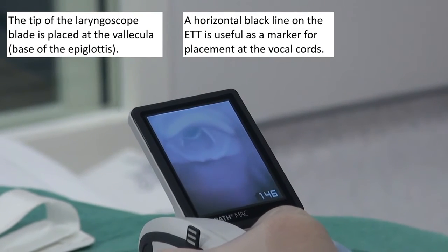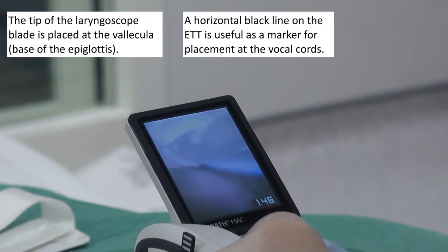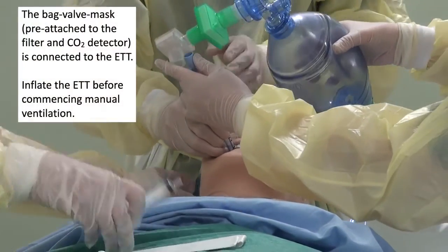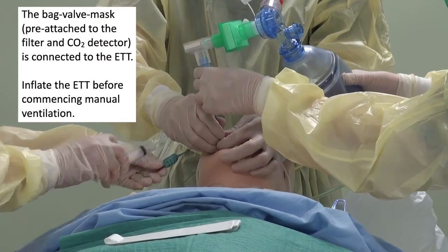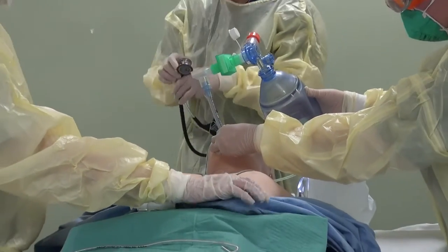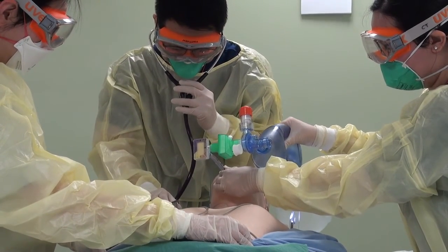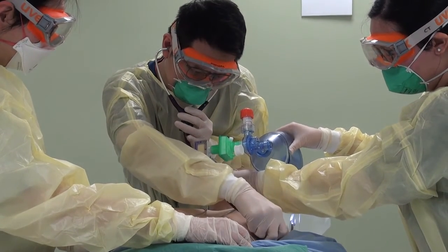Switch your view to the video screen and gently introduce the ETT while keeping the tip of the blade at the vallecula. The ETT is introduced past the vocal cords and the stylet removed. The bag-valve mask is then quickly connected to the ETT. Ensure that the cuff is inflated before manual ventilation is commenced to reduce dispersion of respiratory droplets. Check for color change of the carbon dioxide detector, chest rise, and misting in the endotracheal tube to confirm placement. Five-point auscultation, while commonly performed, may not be feasible with the use of PAPR and may be omitted in that situation.